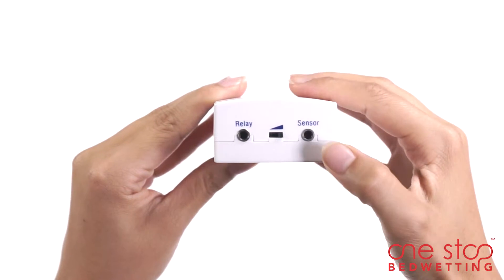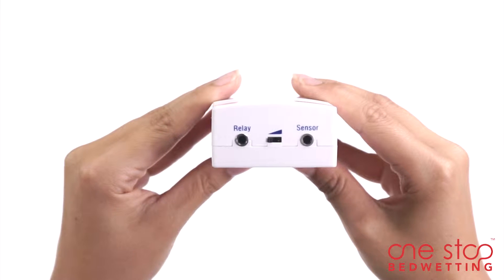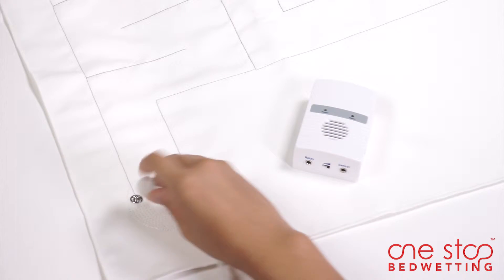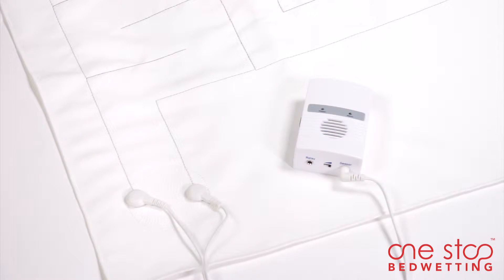You can set the extension button to relay if remote monitoring is required. You will need two or more alarm units for remote monitoring. Now attach one end of the snap-on cord to the mat and insert the other end into the alarm unit. Boost is now ready to monitor bedwetting events.